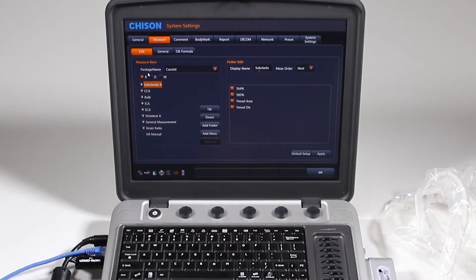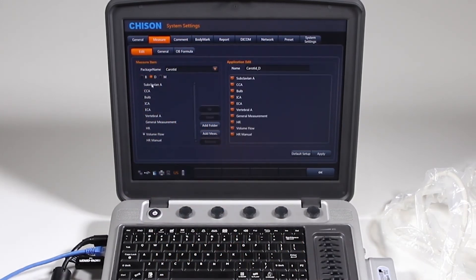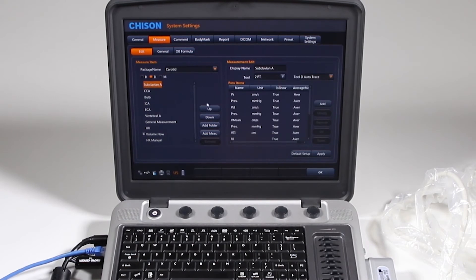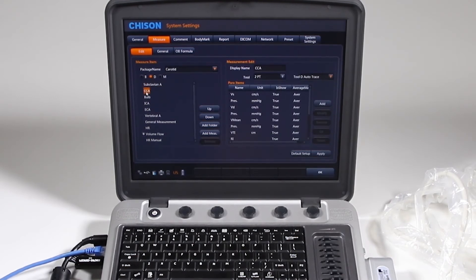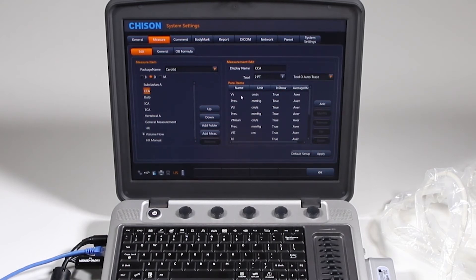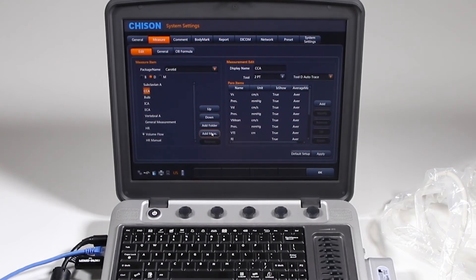And you have your B mode, your Doppler, you can move those up and down, what will appear, and you can adjust the various calculations within that package, and you can also add your own measurements.